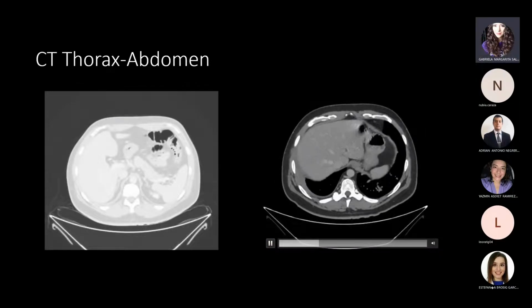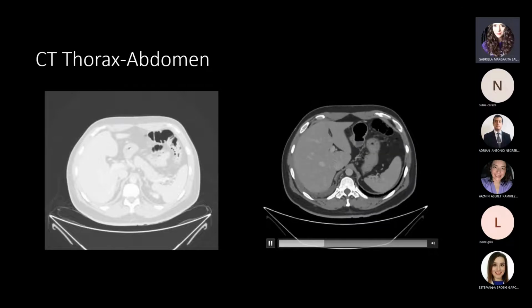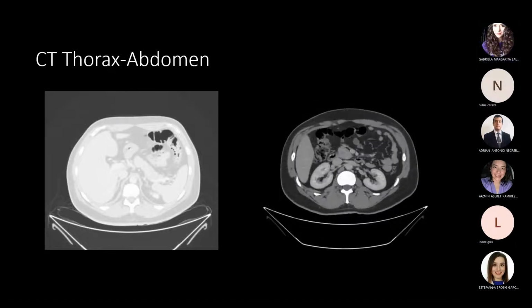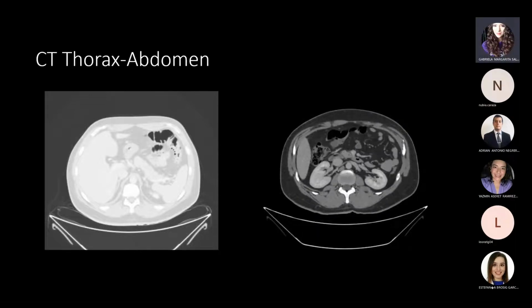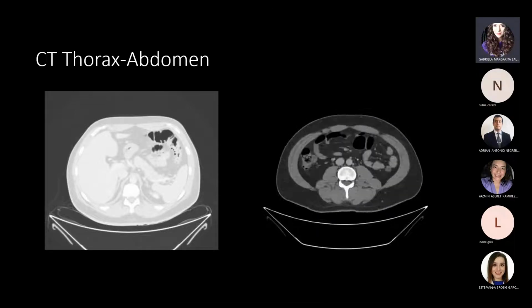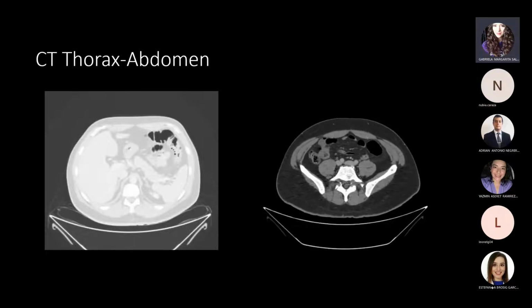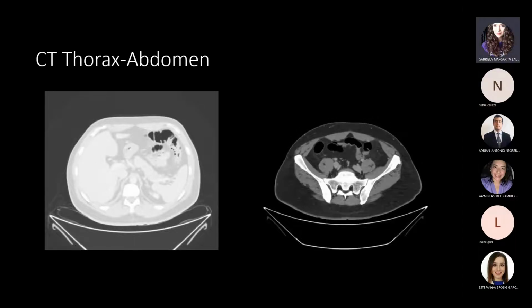The largest one was in the perihilar area, and also with multiple mediastinal adenopathies, and also at the cervical levels.